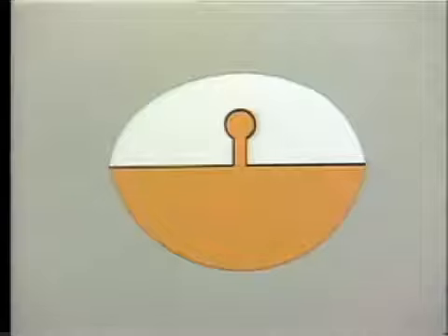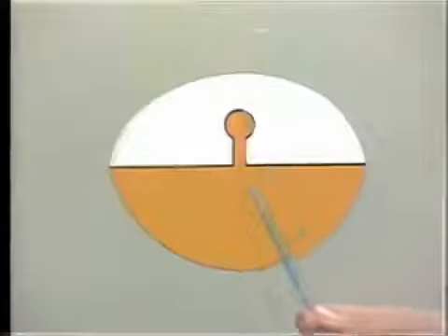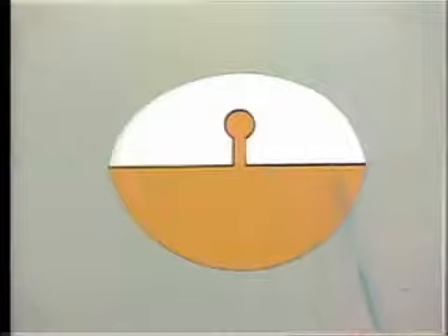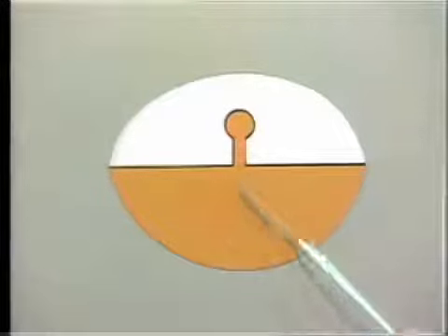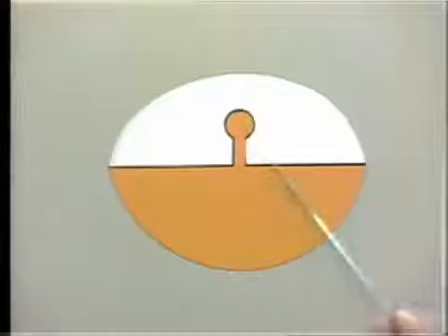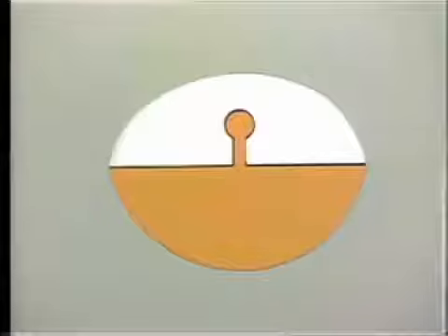In order to avoid this, it's customary to modify this aspect of the pontic by hollow grinding this part of the porcelain around here. In the fabrication of the porcelain, this is hollow ground just around in here where the dotted line indicates. The result of this is that when the backing here is waxed up, wax is carried forward to that line there and covers over this area here, and after it's been cast, this of course appears in gold, so that this fitting surface of the pontic now has a gold apron extending forward here.